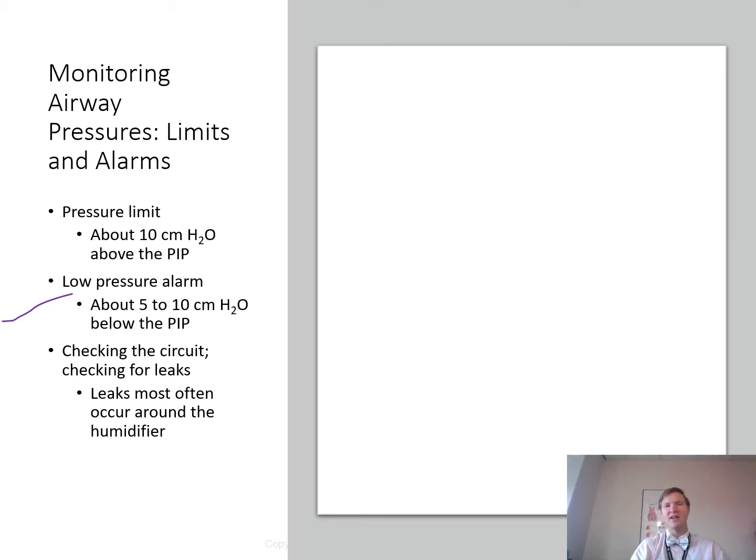So to find a leak, you check the patient's airway by listening to the trachea with the stethoscope, because it could be a cuff leak. So that's one of the things that we'll look at. Is the cuff of the tracheostomy tube or ET tube adequately inflated? If it's not adequately inflated, you could hear abnormal tracheal sounds, right, when there's a leak. So if you listen to the trachea and you don't hear a leak, then odds are that's not a cuff leak that you're looking for. So you just ruled out something pretty quick and easy to fix as well, right?